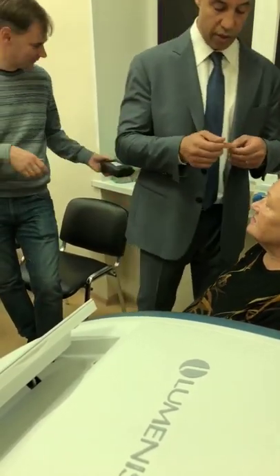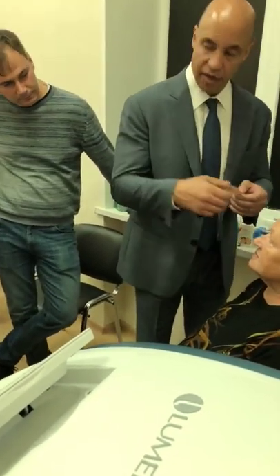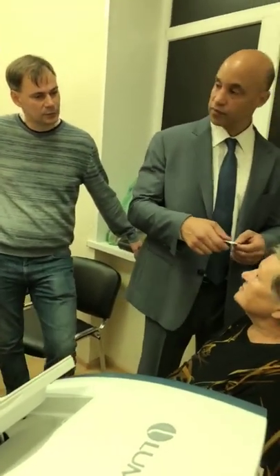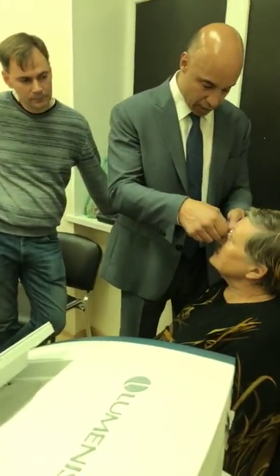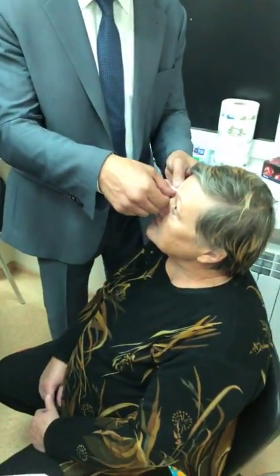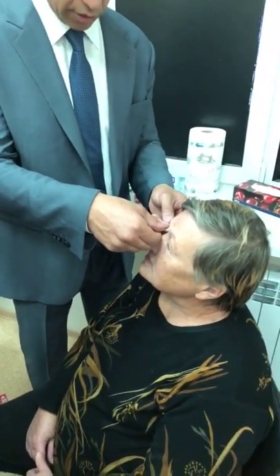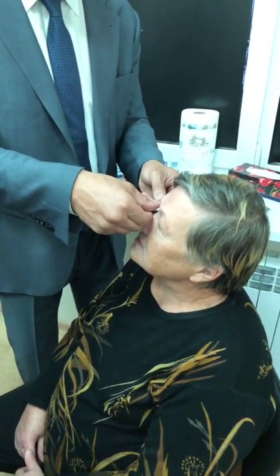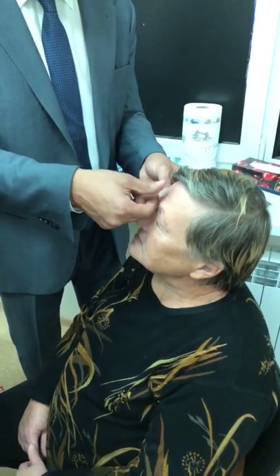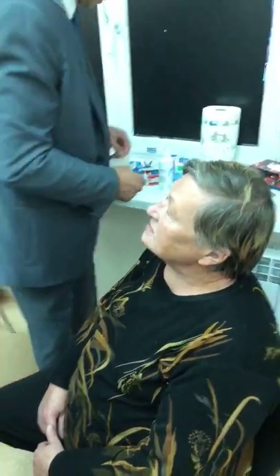Okay, so the goal is, if these are what you're going to be using, I would cut them down and make them a little smaller and have them open eyes and look up. Toto, look up. And then you just want to put it right where the eyelashes are. Now Toto, close her eye. No, Toto, close. Keep it closed. Okay, good.